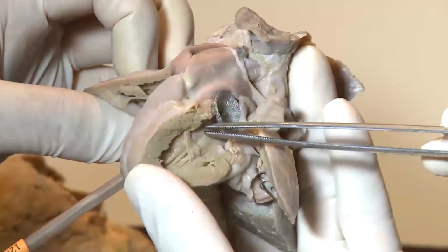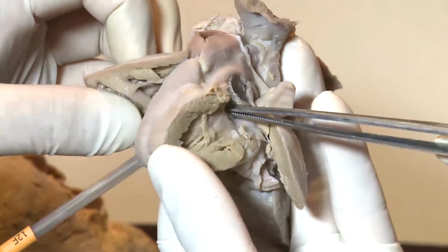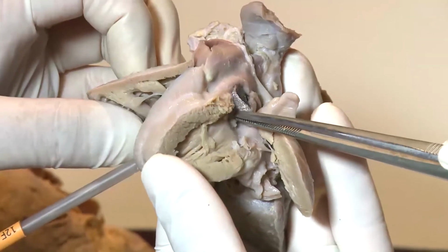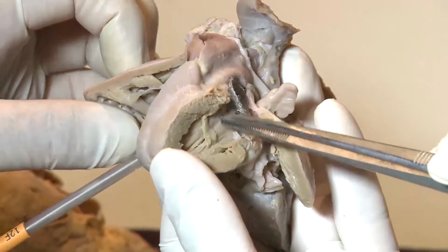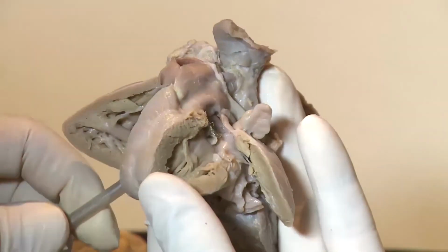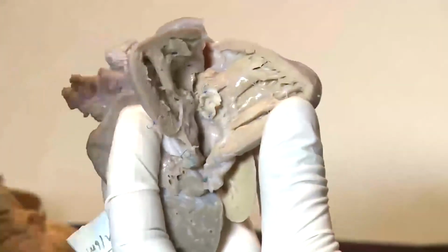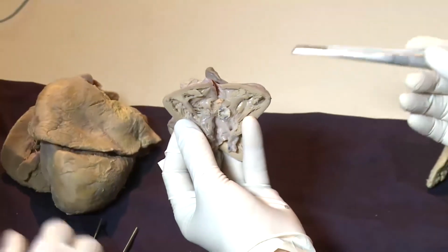Still, the conduction axis is exposed to the endocardium, so it may be necessary to make a kind of pledget-like tissue to protect the endocardium from the device. Now, another company is considering an absorbable device. Maybe the ideal one.